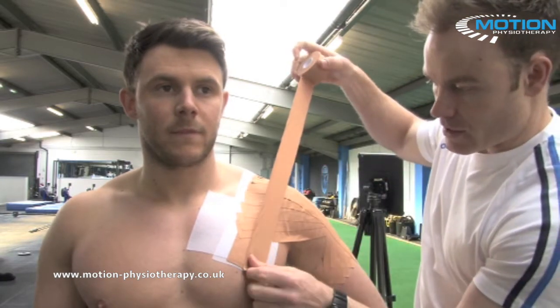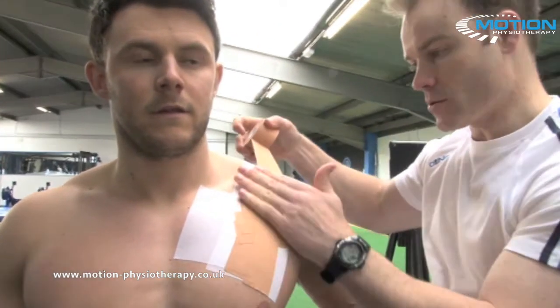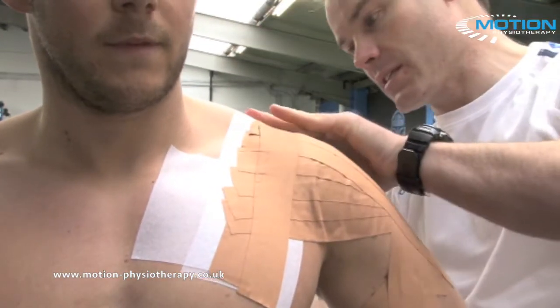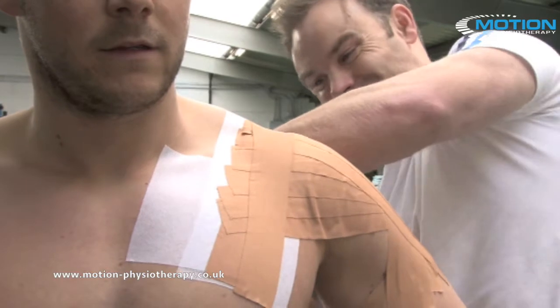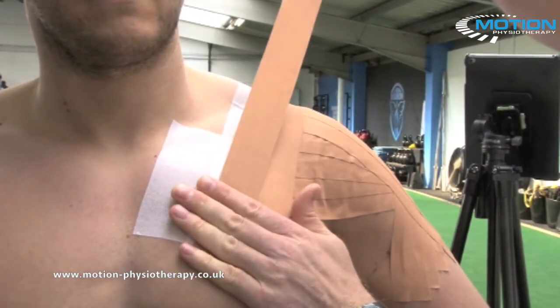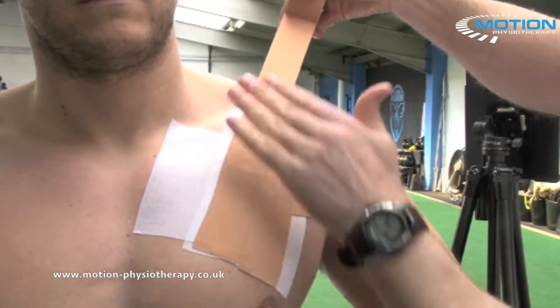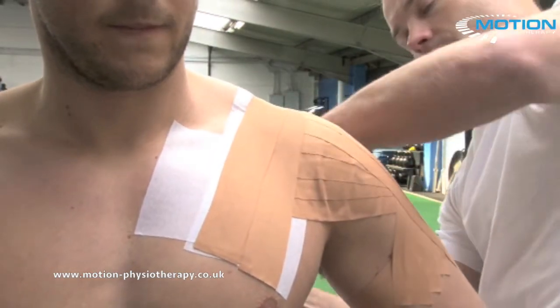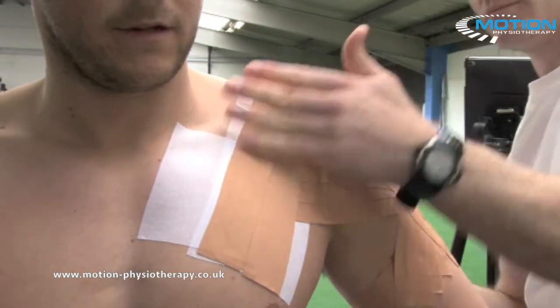Now redo your anchors but slightly offset. Starting a little bit lower than the first one, tracking over the AC joint, coming a little bit above that back anchor. Then the upper arm anchor again slightly above where you did the initial one, coming over the AC joint and finishing on the back.